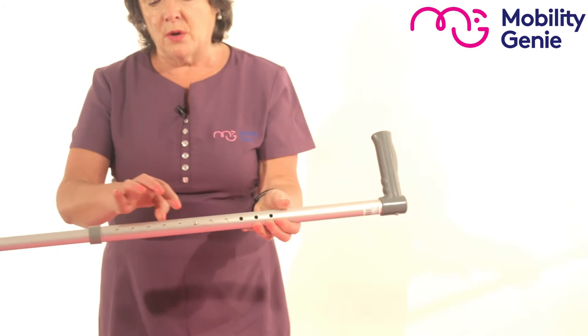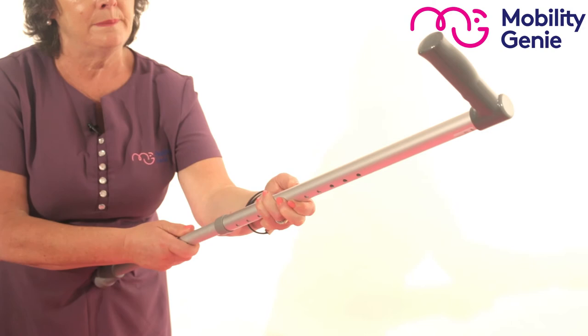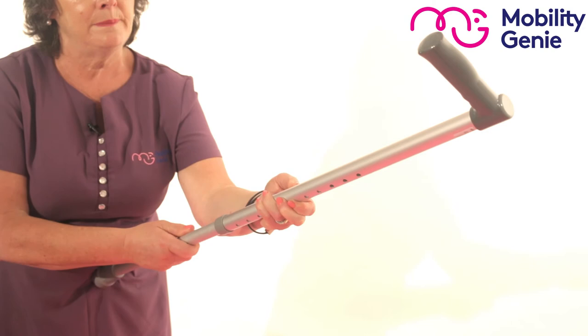So to adjust the walking stick, you look at your button at the front and the button at the back. I find if I hold the stick against me, it gives me more strength to press those two buttons together at the same time, give it a little twist and move it up or down. And then it clicks back into place.